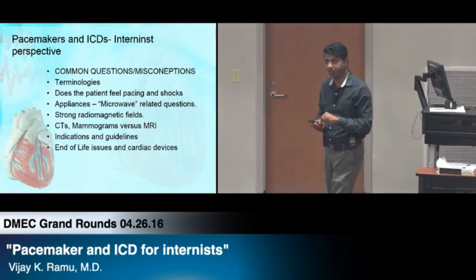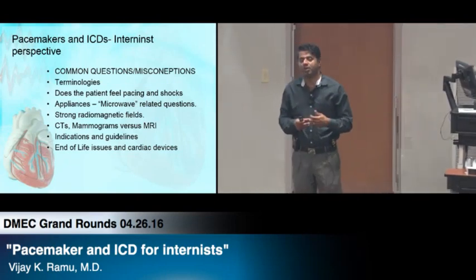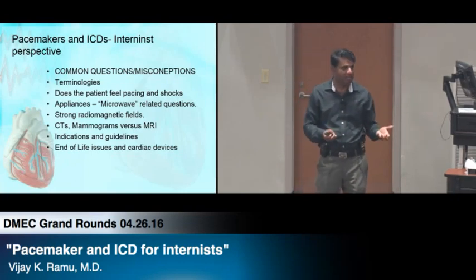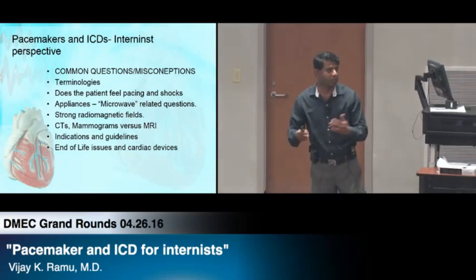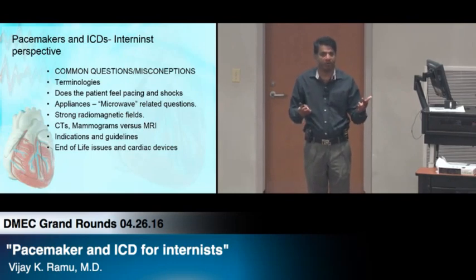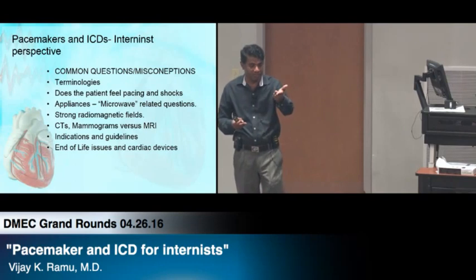MRI, these are all more clinical questions, not board questions. Pacemakers and MRIs, defibrillators and MRIs. For many, many years, pacemakers and defibrillators meant no MRI. Okay, what's the problem with that? Magnetic field, what's the problem with this? What would happen? Somebody said?